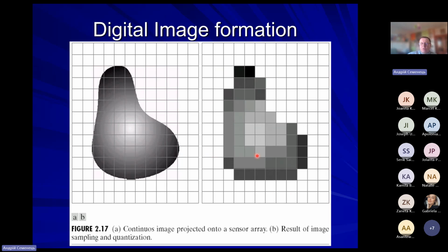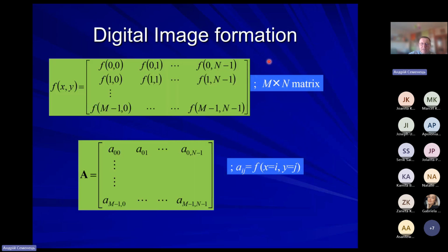So it's low resolution. It was a very big problem for decades. The quality of digital images was very low. It was square-like forms until a relatively recent time, when it became possible to create very small sensor elements and create matrices large enough to generate high quality images. So in fact, how has a digital image been formed?